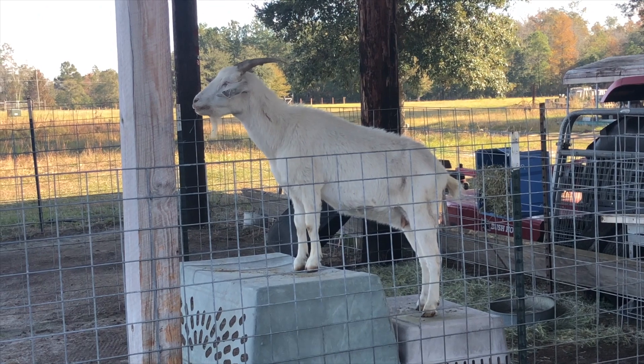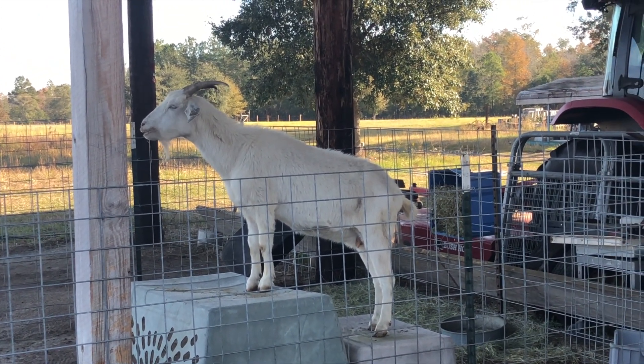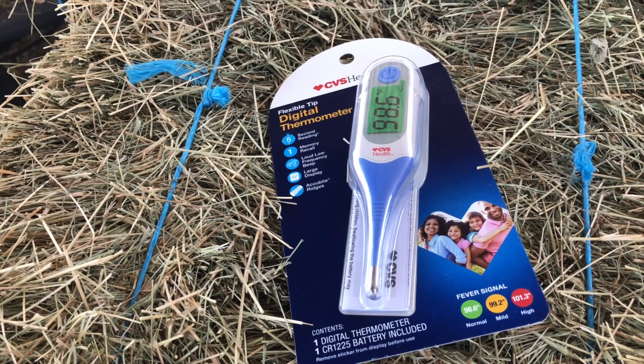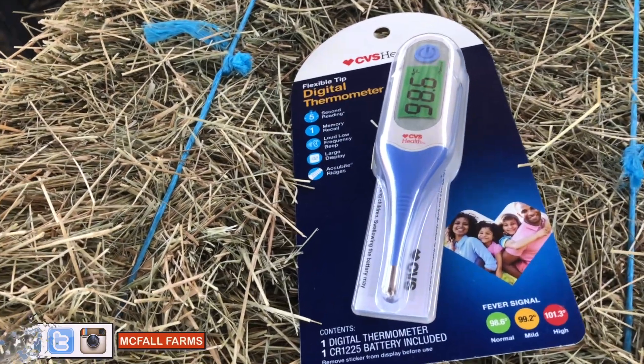There are three things you absolutely have to have in order to take a goat's temperature. Number one: you have to have a goat — seems obvious enough. Number two: you need a thermometer. Any kind will do — the old-school glass kind, or these days I prefer the digital. You can spend a few extra dollars instead of having to wait 60 seconds.